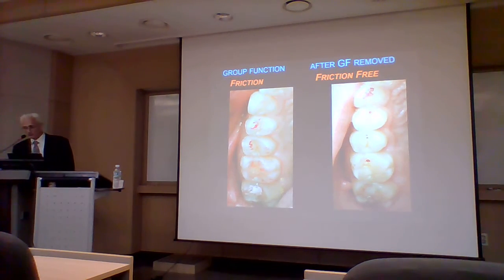So then we went ahead and treated the prolonged disclusion, which is, remember I said lines of articulating paper. You can see all these lines. That's what the long disclusion looks like.